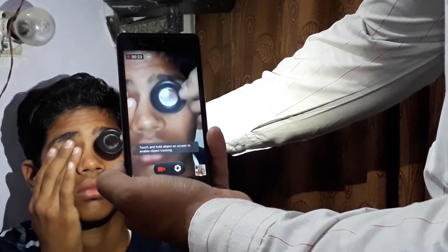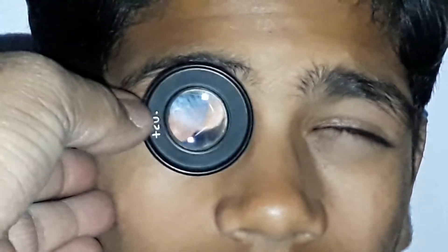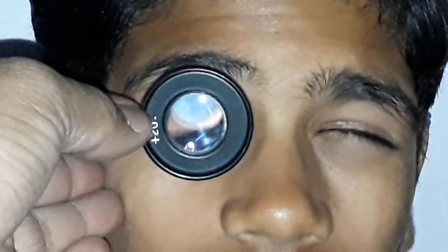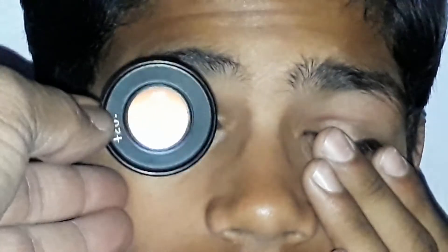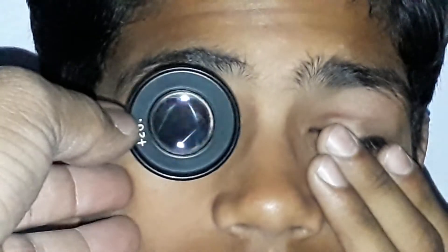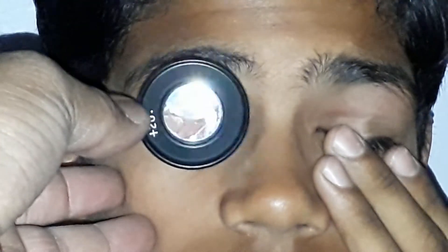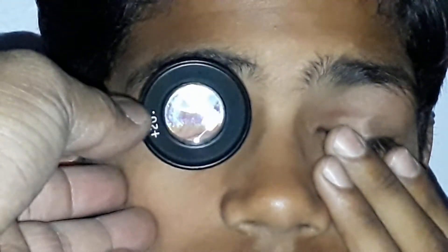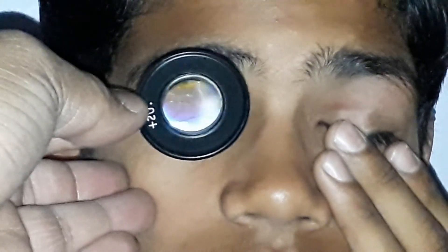By this technique you can examine the optic disc, fovea, macula, etc. The field obtained by this technique is greater than direct ophthalmoscopy but less than indirect ophthalmoscopy. For getting the peripheral part of the retina, you can try a big aperture 20D or 30D trial lens available at optical shops.